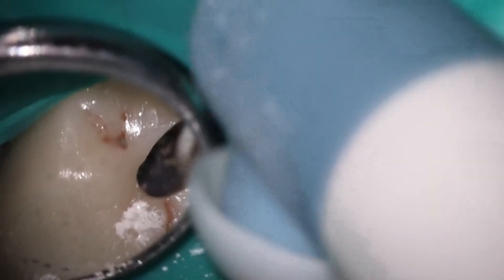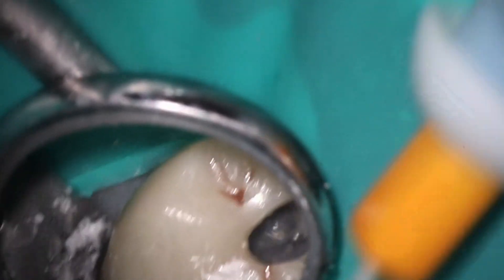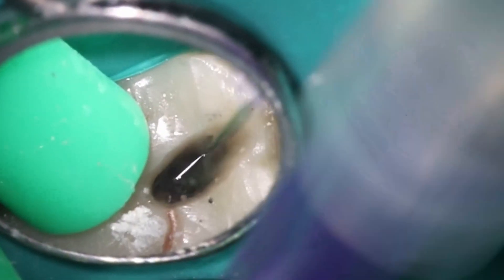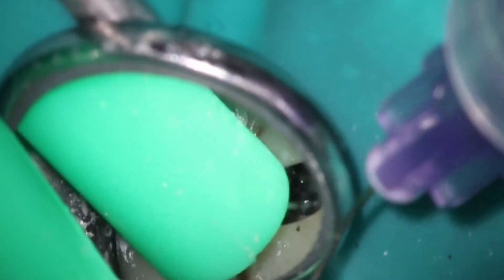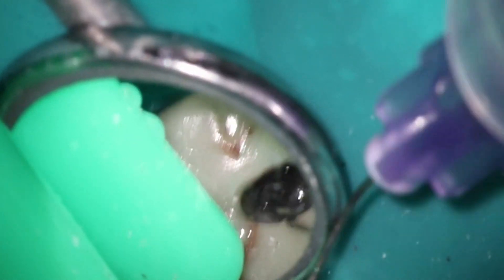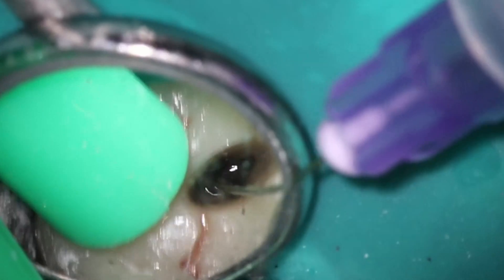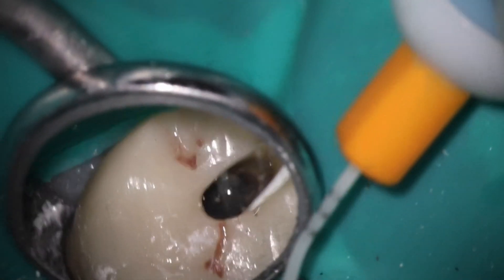I'm not going to say it works every single time, but if you're having trouble getting down a canal, take a break, come back with fresh eyes, place the calcium hydroxide. Oftentimes you'll find that it just drops right away — and that's what you saw there; the 2006 went straight to length in the MB2. I know that it joins, so I'm not going to go back and check length. Here we are doing the final rinse process. Another commenter asked how I get the calcium hydroxide out — we go through a full thing of bleach, a full thing of EDTA, and then just a little bit of isopropyl alcohol to make sure everything's nice and dry.